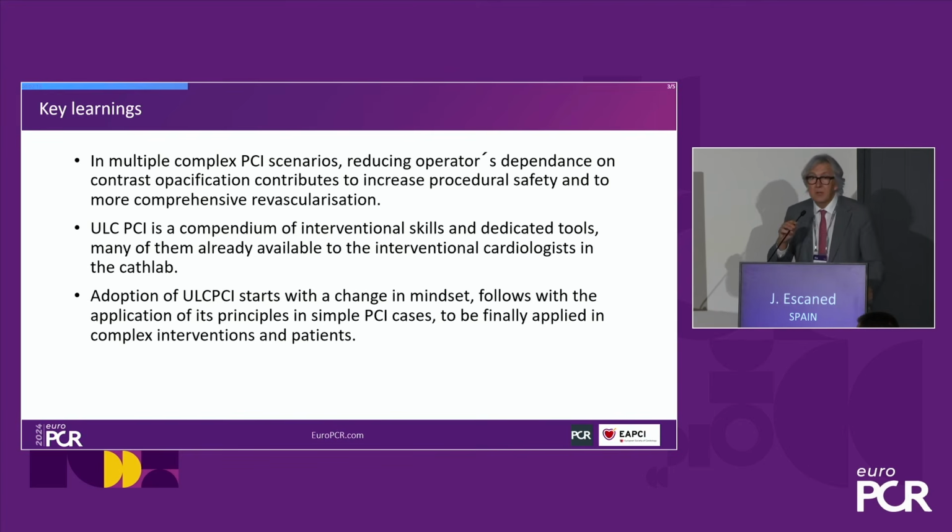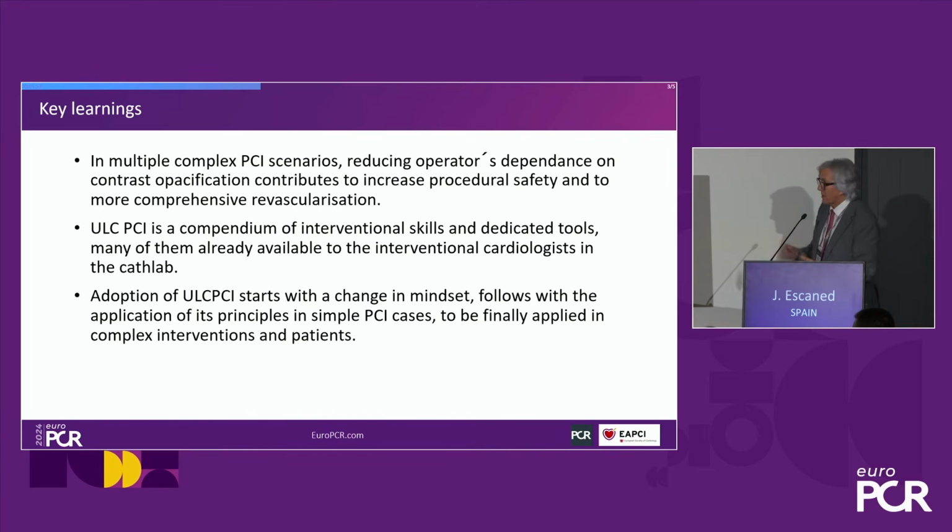Nieves showed us how displaying in front of you the previous diagnostic angiogram can be extremely important, and performing saline injections to know if you have engaged your coronary artery. Adoption of ultra-low contrast PCI starts with a change in mindset, follows with the application of its principles to simple cases. I think the case that Matthias was showing us could be one of those cases, to be finally applied in complex interventions and patients like the one that Nieves was sharing with us.